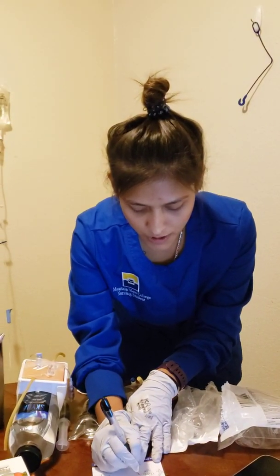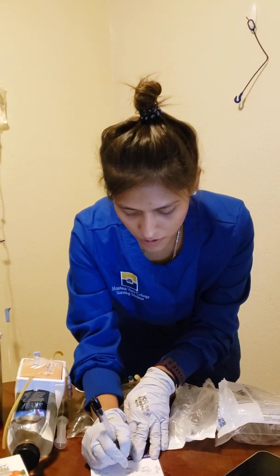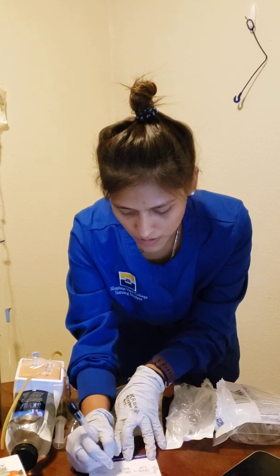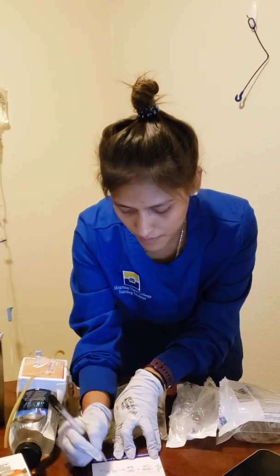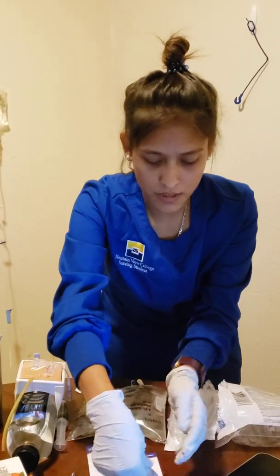I'm going to do my dosage for the ampicillin, 500 mg over 30 minutes. And it's in a 100 ml bag, 30 minutes. So I'm going to times that times 2. And I'm going to program my pump to 200 ml per hour. So let me show you that just quickly.